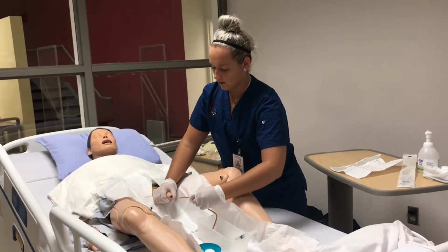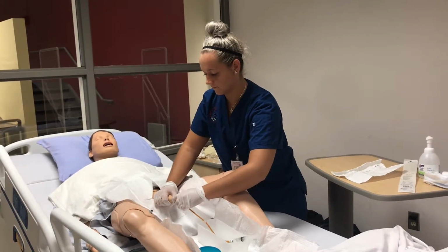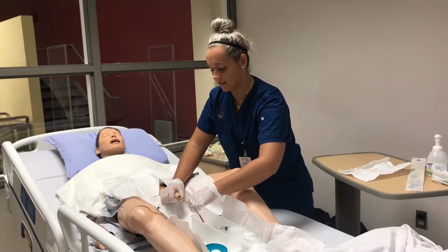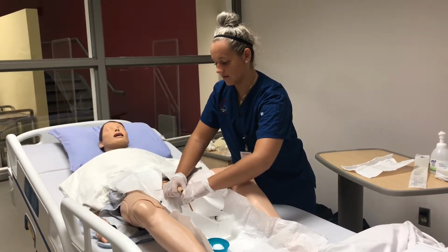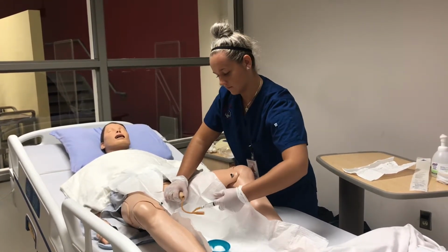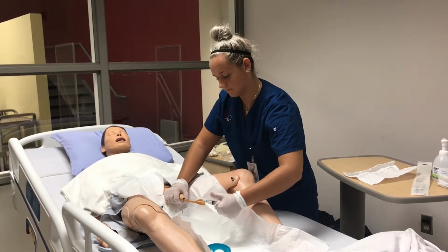So to begin, you're going to want to slowly insert, and you're going to be inserting the catheter until you see urine. Once you see urine, you can then inflate the balloon slowly.